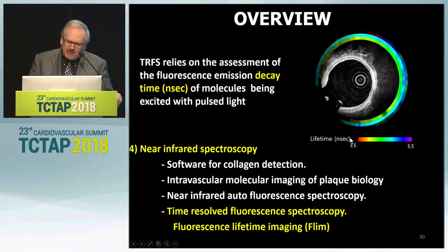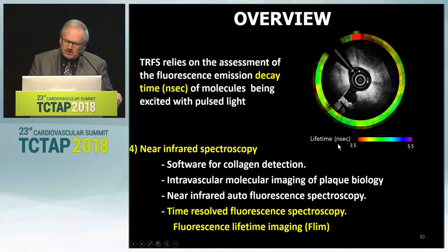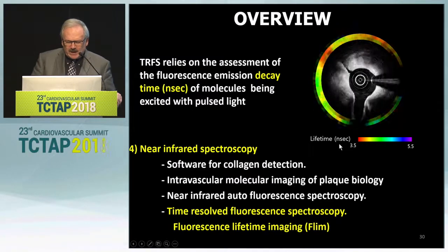And as you could see, the color barcode is now expressed in nanoseconds because the OCT has the speed of the light.